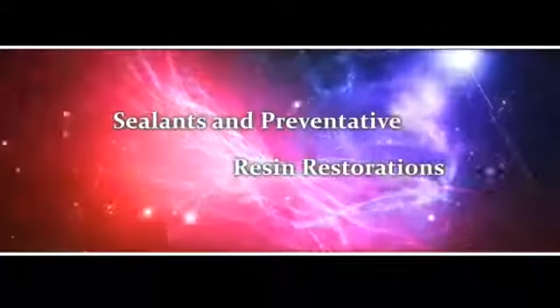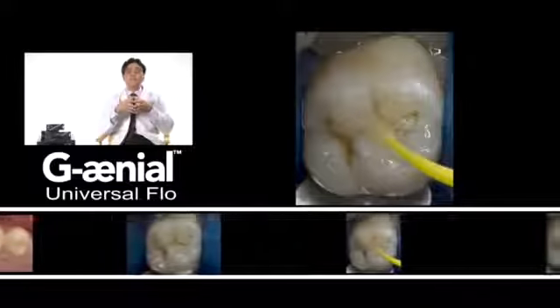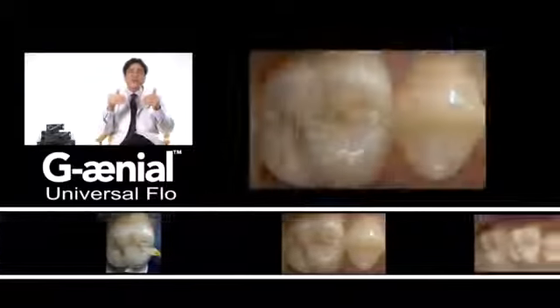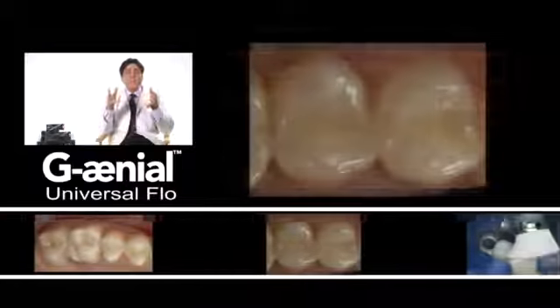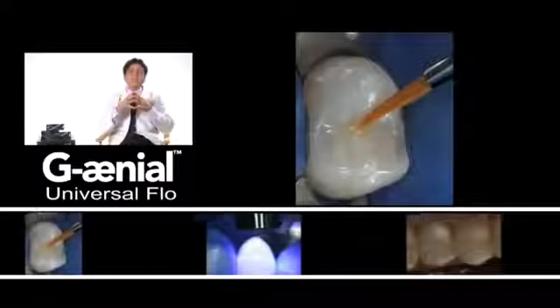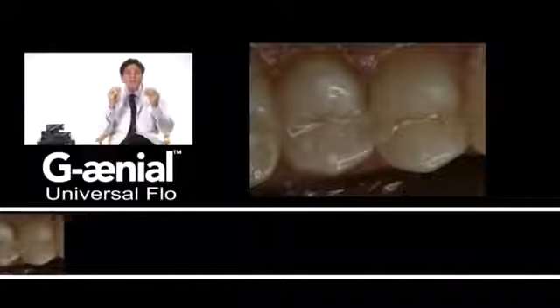As sealants and preventative resin restorations, next generation flowables can be utilized as composite surface sealants, pit and fissure sealants, and preventative resin restorations. These highly filled nanomaterial formulations can be cured in a thin film and have the potential to increase the wear resistance of posterior composite resin restorations, since the interparticle spacing is reduced and the filler particle density is increased, and thus can provide more reinforcement and protection of the resin matrix.